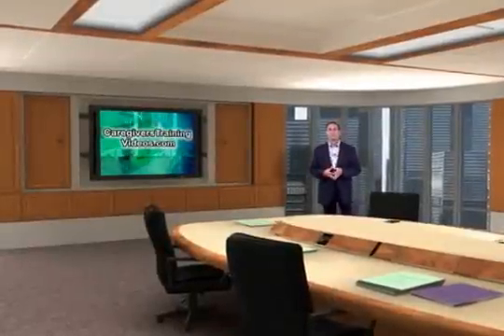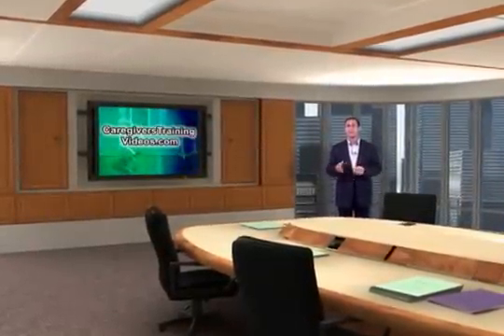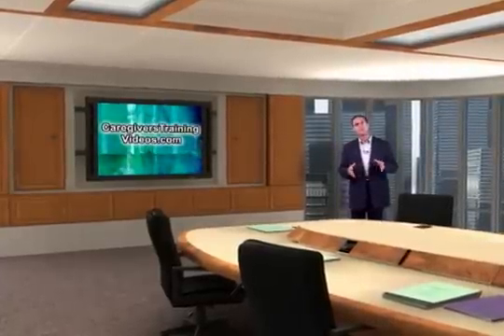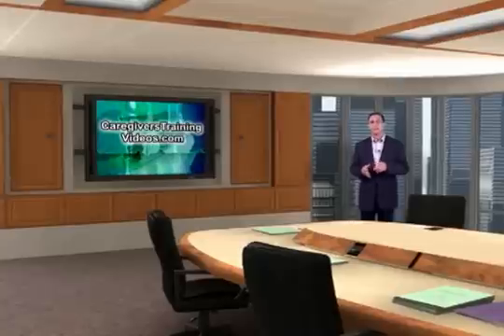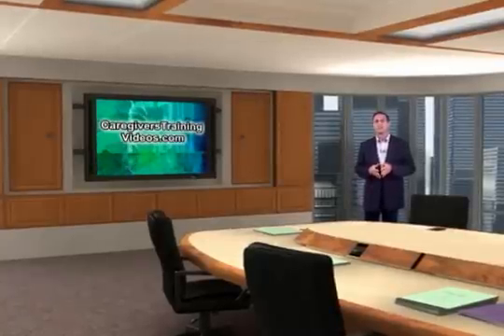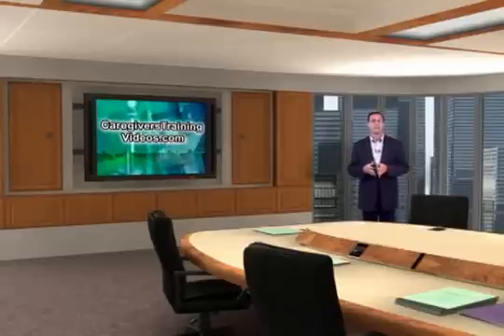Patient lifts are used to enable the caregiver to transfer a resident from the bed, wheelchair, commode, floor or similar surface to another surface and reduce the risk of injuring yourself and the resident. Patient lifts mainly fall into two categories, manual and power operated. Some versions are collapsible in design, while others are designed to assist with ambulation, gait, and automobile transfers.